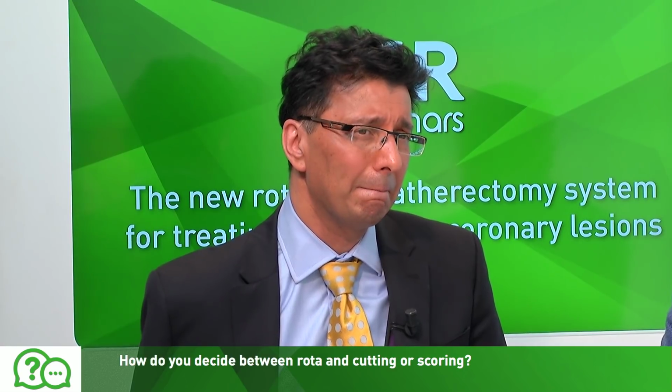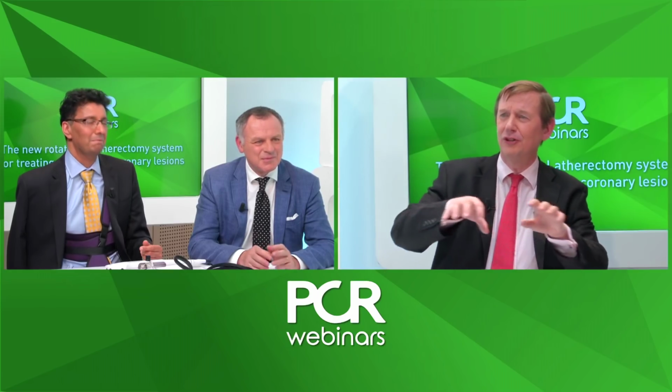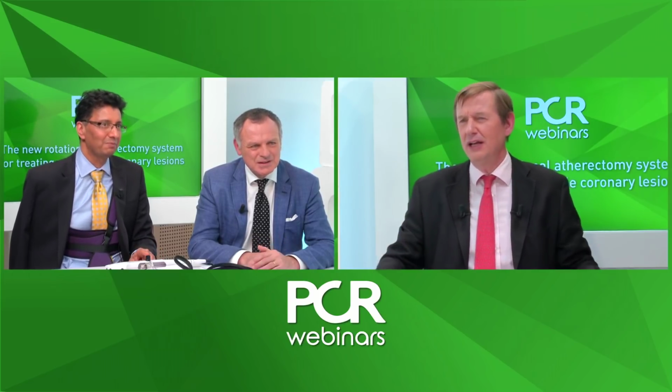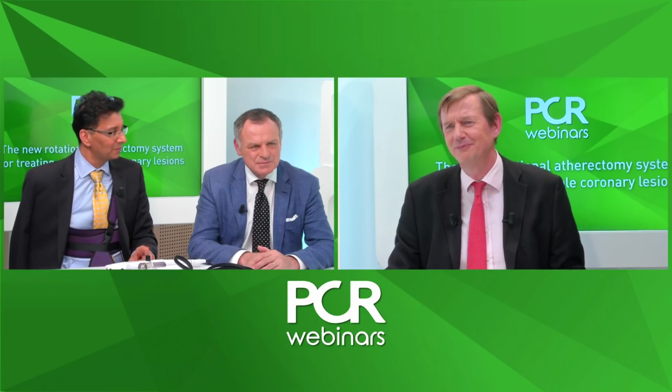There's a very good question about technique and how to avoid the jumping forward of the burr when you activate it. Any tips that you can try to avoid that? Sometimes there's a lot of tension in the system when you've placed the burr in what you think is an appropriate place, and when you activate it, it moves forward. Are there any tips you can transmit to us to avoid that?